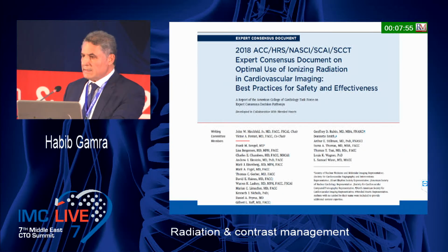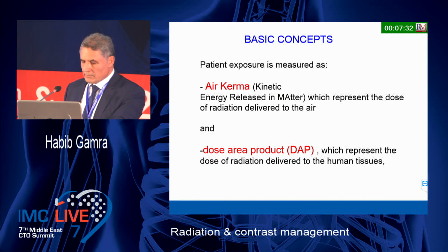And this is a very important issue, to a point that there is a very recent expert consensus document that was published by the American College of Cardiology with other societies on radiology, radionuclide, etc. I suggest to you to read it because it is very rich and there is very important information for radiation protection and safety. Now, before we go into the details, I just would like to remind you about some basic concepts. I'm not a biophysician, so I really learned in the preparation of this talk, but there are some words that you might encounter if you read that document or other documents about this subject.